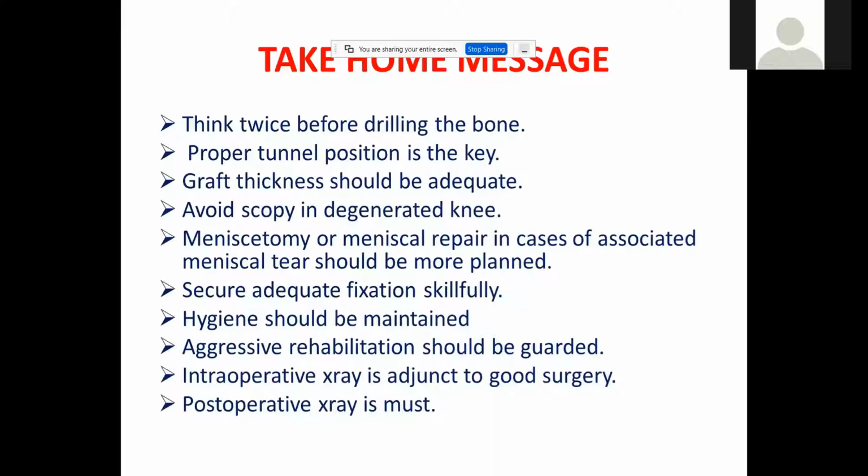The take-home message from my side is: think twice before drilling the bone. Drilling a bone is most important. There should be no hurry. There is no great thing in doing an ACL in 20 minutes. Go for 1.5 hours, but go for a good ACL, because it's his life. The patient in whose bone you are drilling is not you or me. So before drilling, you have to think twice.